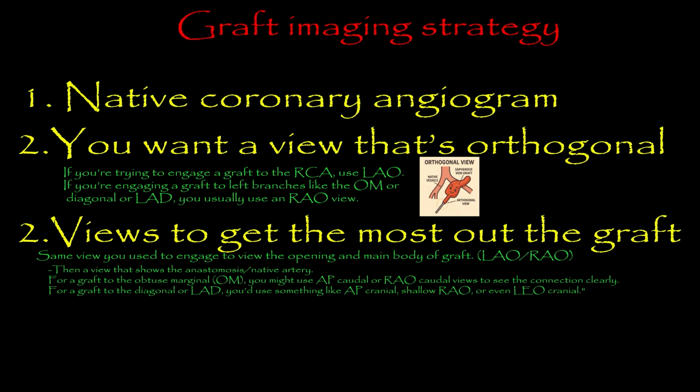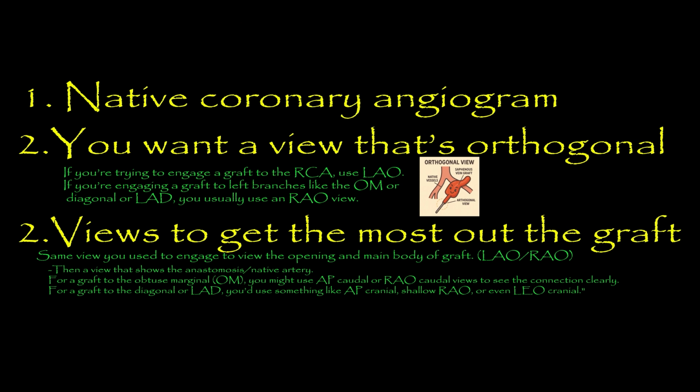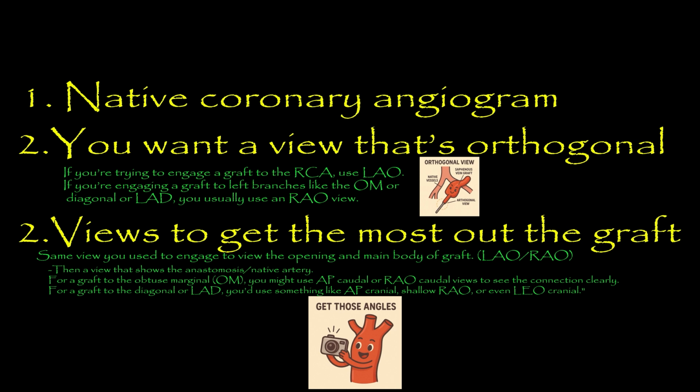We want a different view from our engagement view to really see the disease or runoff. So the recommended views, if we're talking about the OM graft, we may want to use an AP caudal or RAO caudal, and that'll usually let us see the connection clearly. And as for the diag or LAD, we'll use something like AP cranial or shallow RAO, or even LAO cranial. The key idea is you don't just want to shoot one view. You need multiple angles, one to engage and another to show the connection. So usually two works.